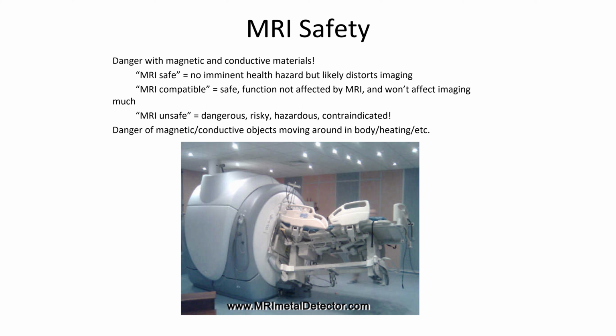It's critical. There have been recent cases even where people have died because someone brought in an oxygen tank for the anesthesia machine, and the oxygen tank flew into the MRI machine and smashed a kid's head. And so these things are really obvious, you would think, but there's safety measures in place for a reason, and you really need to follow the protocols and be aware of what you're doing.